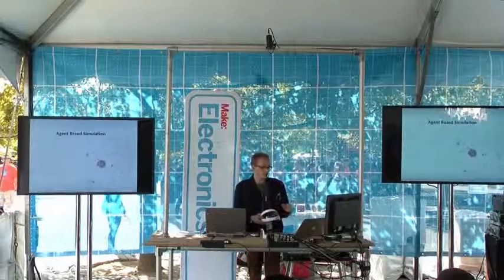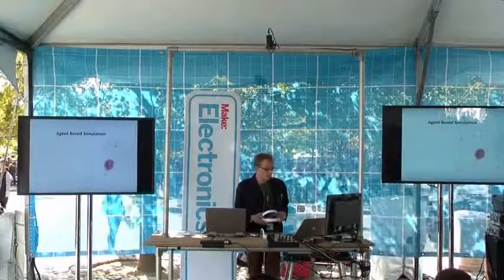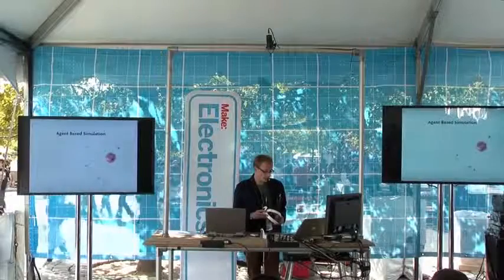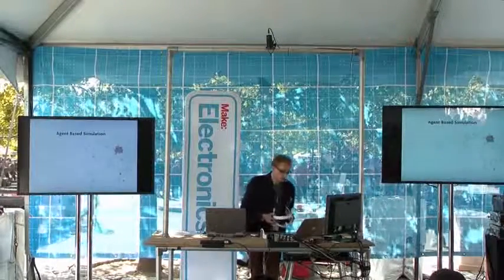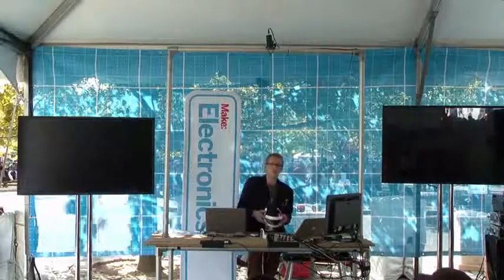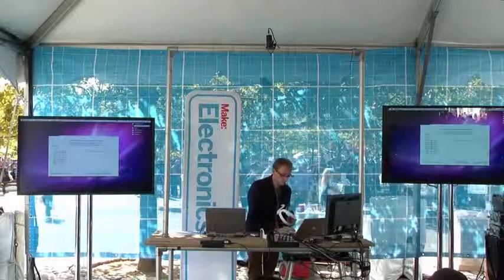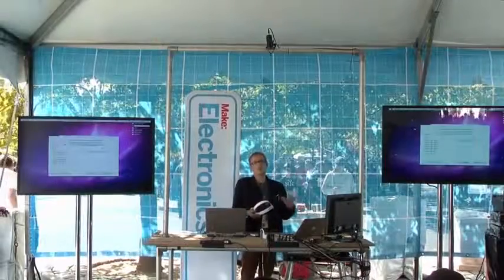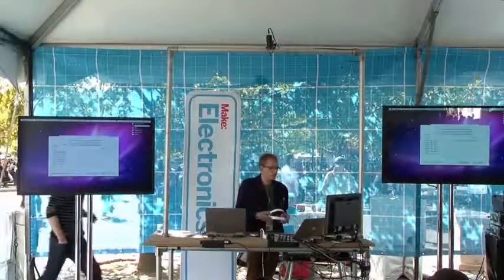The game world itself is done in NodeBox OpenGL, an open source software application that can create graphic visuals by programming Python code. The game itself consists of graphical elements.